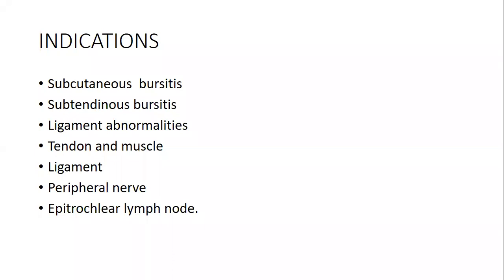And I should also mention here that when you are doing an elbow joint, sometimes you can be focused on the patient's body part, and sometimes the body part may be so symptomatic that you even know exactly where the pain is. But what is key is to have a comprehensive assessment, or rather evaluation, of the joint so that you can have the whole anatomical structures being assessed. You can have subtendinous bursitis, and this also may specifically affect the tendons.